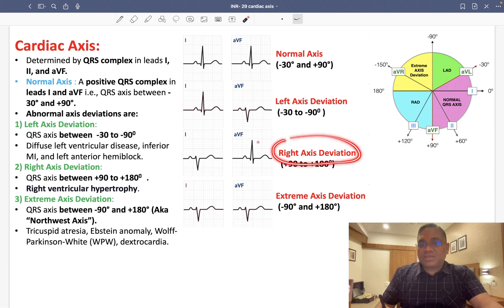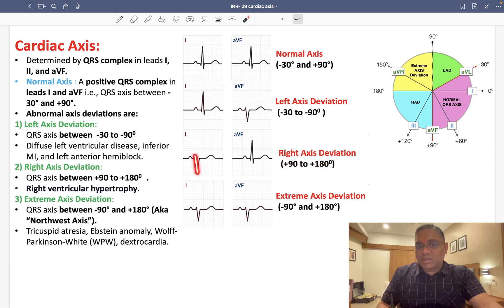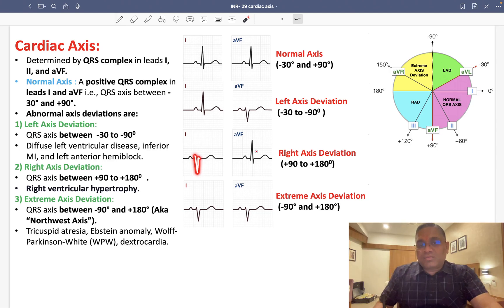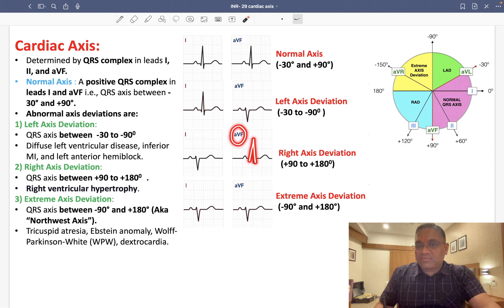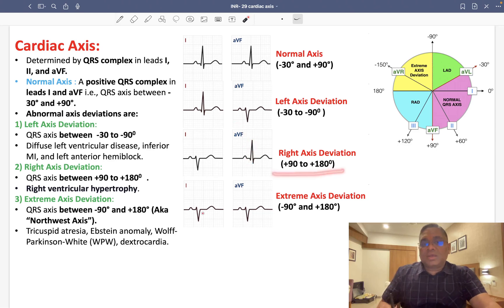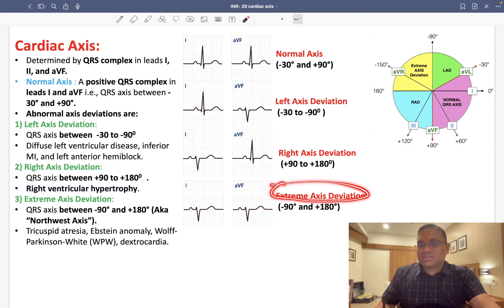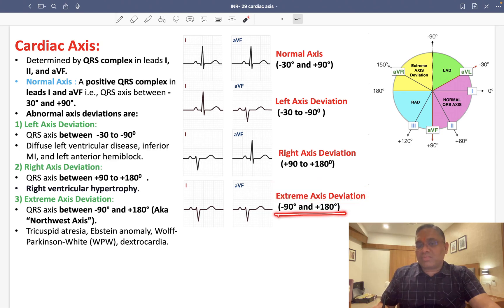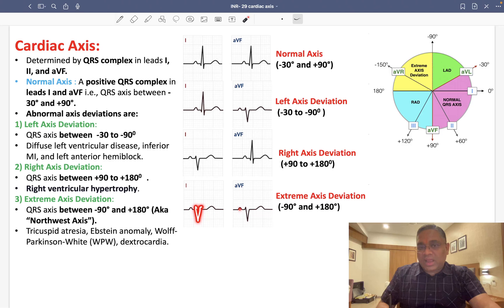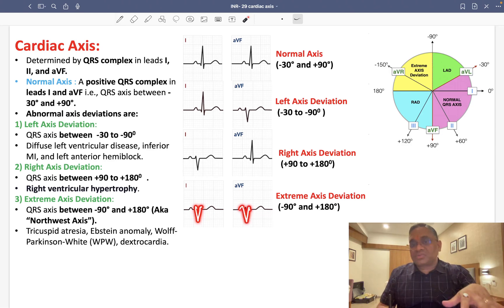For right axis deviation, when you look at lead 1 you will see QRS complex having negative deflection, whereas in AVF the QRS deflection will be positive — ranging from plus 90 to plus 180 degrees. For extreme axis deviation, the deviation ranges from minus 90 to plus 180 degrees, and you will find that both lead 1 and AVF have QRS complex going down — negative deflection.